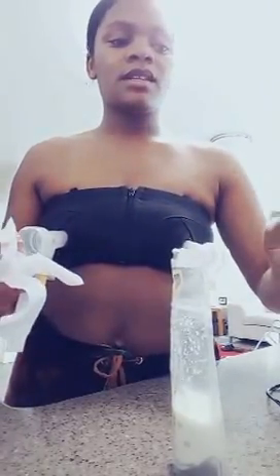Now I'm going to use the wipe to clean all parts. You should usually wash every part before and after use. Sometimes, depending on how much I've pumped or how messy it's gotten, I'll just use extremely hot water to clean all parts. So I have my milk, and it looks like we have a little under 2 ounces.